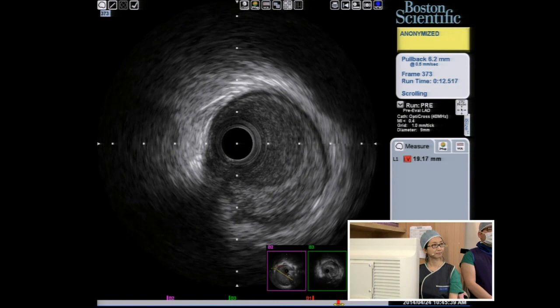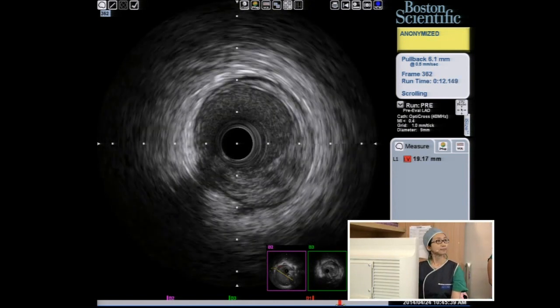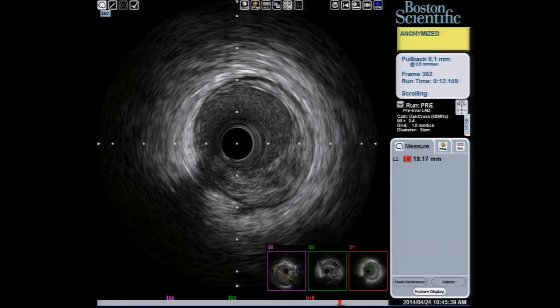And in fact, what you've just said, Marty, is absolutely true on the IVUS. And Dr. Kang will show you that the plaque in the left main runs along the roof of the left main, from the LAD superiorly back into the left main, beyond the origin of the circumflex. So it is not something we could deal with by a simple ostial technique. Dr. Kang, do you want to run the IVUS?